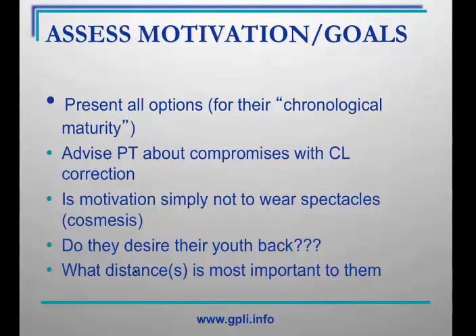Of course, I love to tell patients that this correction is necessary, not because they are aging. I never use the aging word, but because of their chronological maturity. I also tell patients that these are dynamic pieces of plastic that move on the eye with the blink, and that in many cases, multiple corrections are in front of the eye at the same time. So their expectations, therefore, are not too high.